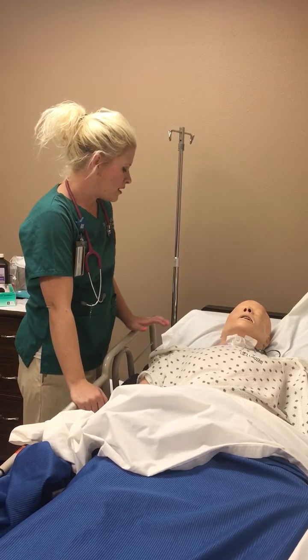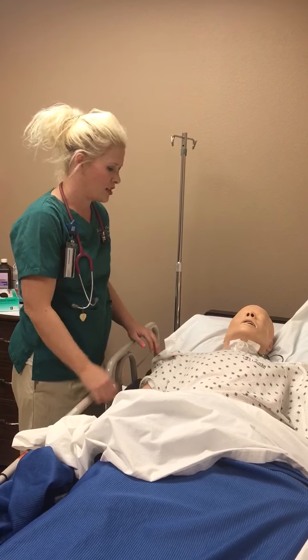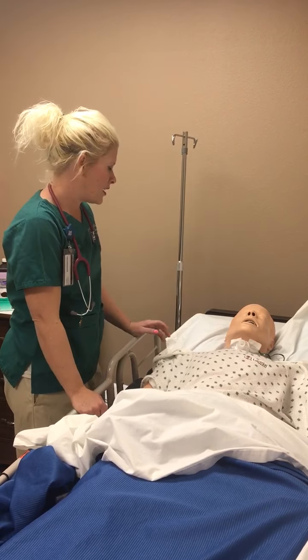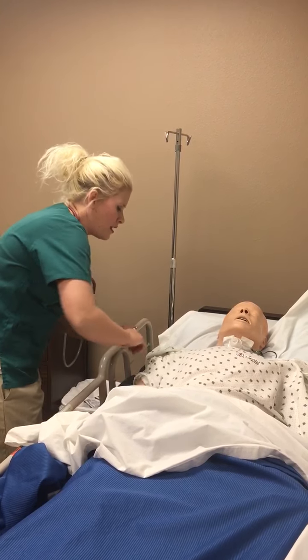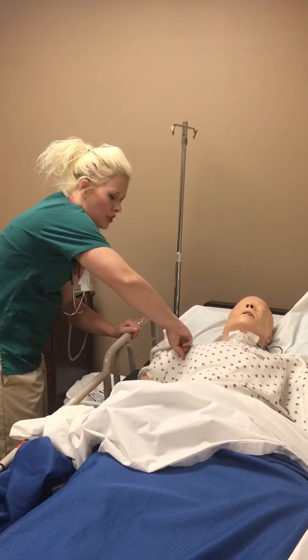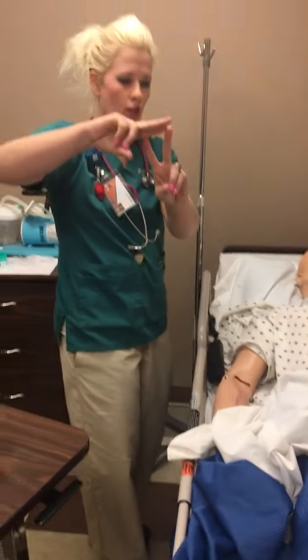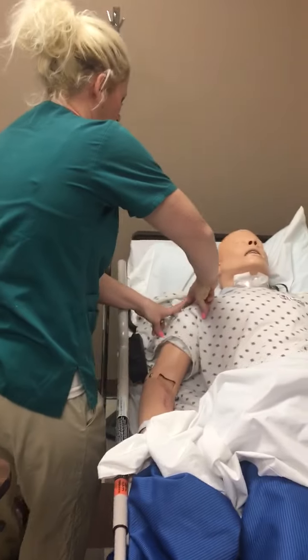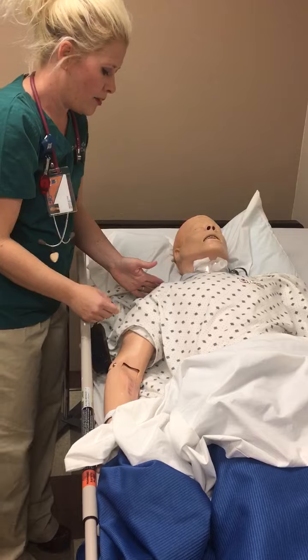Okay? I can give an IM injection in a couple of different places. Because it is the flu, we're going to go ahead and administer in your deltoid. To find that place, I'm going to take 2 fingers below the acromion process. I'm going to do my 2 fingers, and I'm going to go right into the middle. We can go in the right or the left arm.